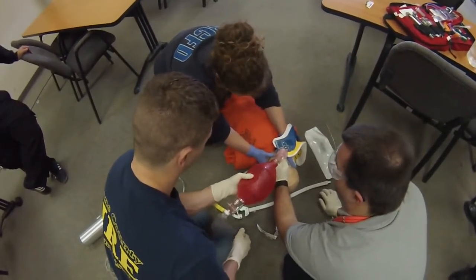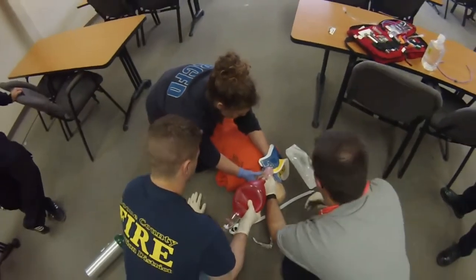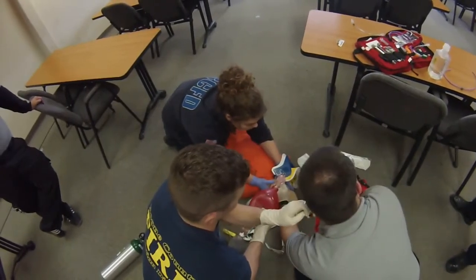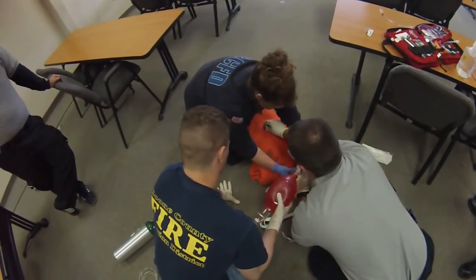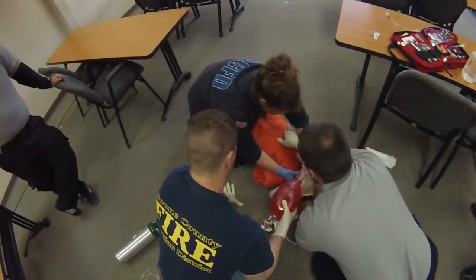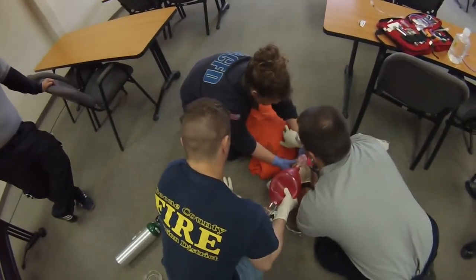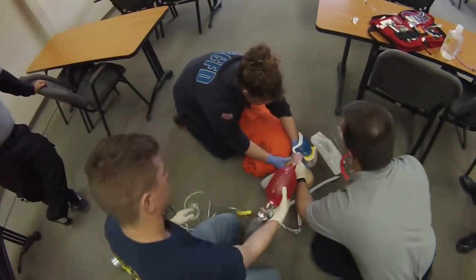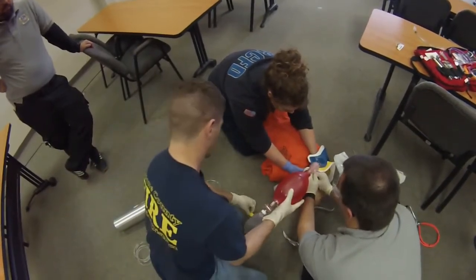Breathe. Chest rise and fall — chest rise, yes. I'm looking for capnography. Do I see a waveform? There is a waveform on the capnography. I'm sitting over the epigastrum — it's quiet. I'm sitting on the left side — you hear something. Left side, right side — same thing. Decent sounds, pretty much equal. Good tube. Good tube. Good tube. This line is set.